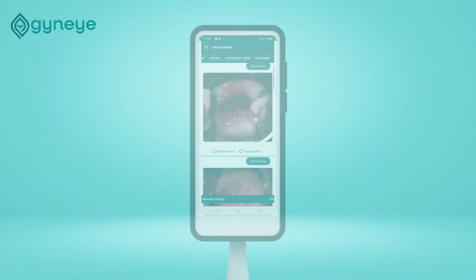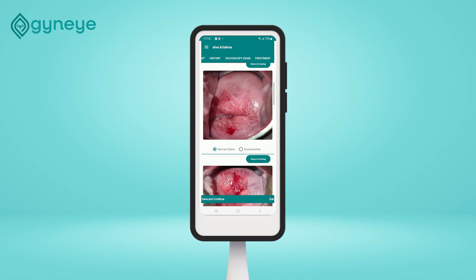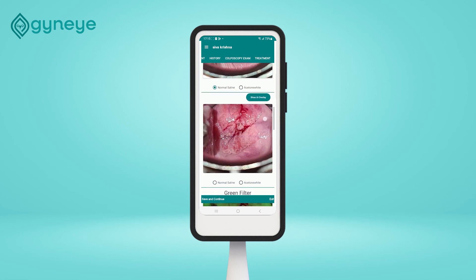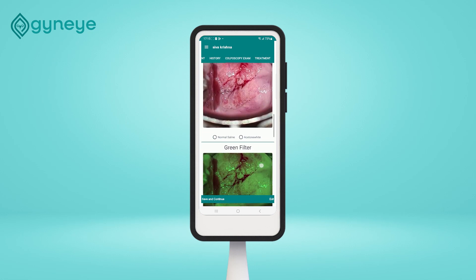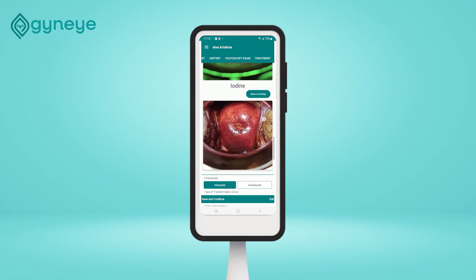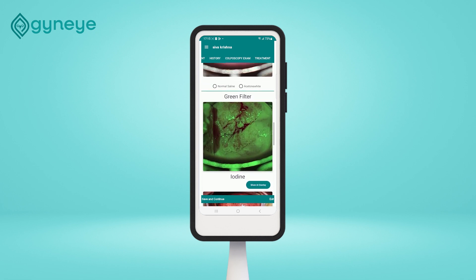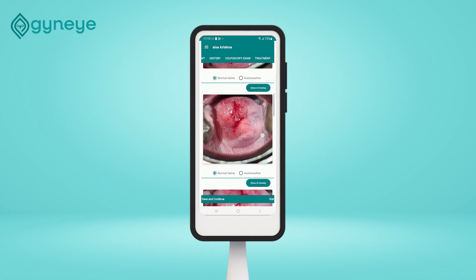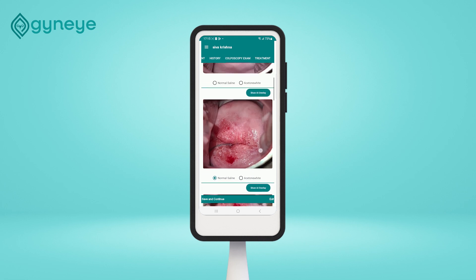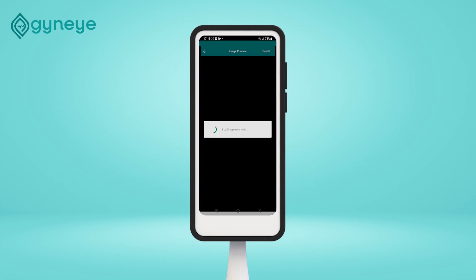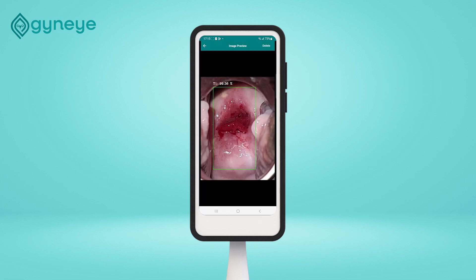Now that you have completed the colposcopic examination, you can review the images individually — for example, using the AI overlay — evaluating the cervix in detail and possibly identifying the acetowhite area as the optimal site for biopsy.